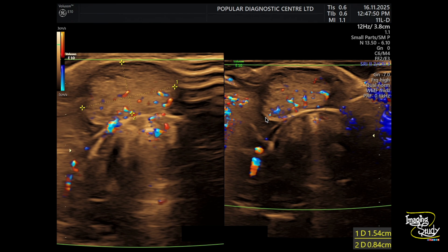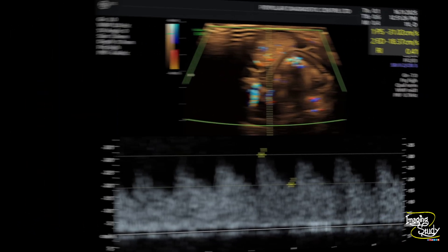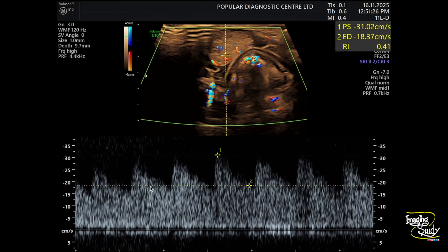On color Doppler, you can see a good amount of vascularity within the parenchyma. We then took a spectral sample from this internal vascularity, showing monophasic flow with a good amount of flow on diastole. This type of flow pattern is similar to thyroid arteries.